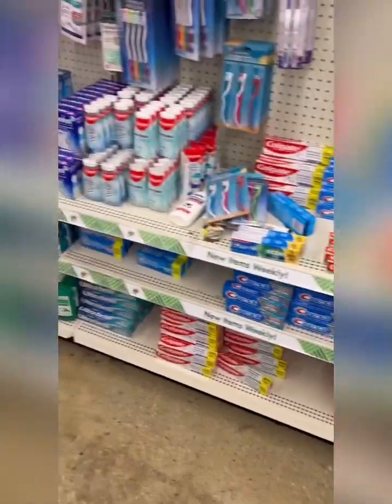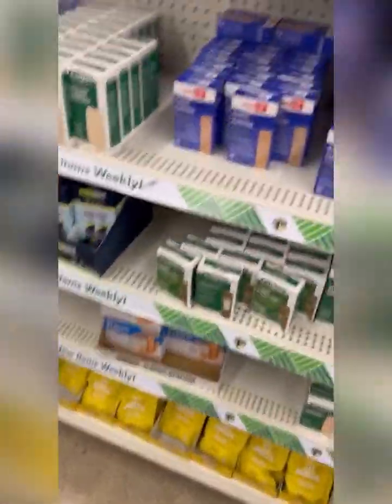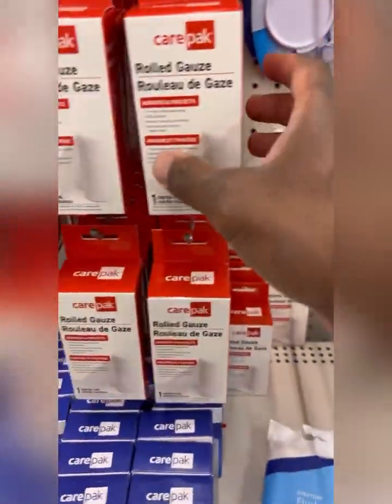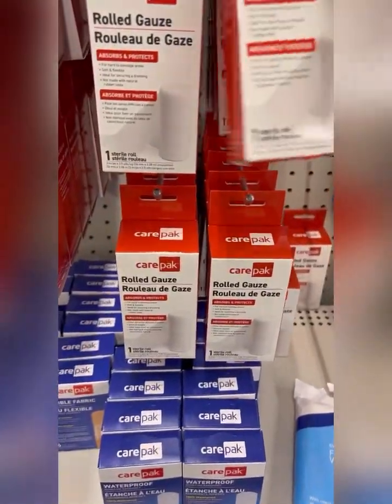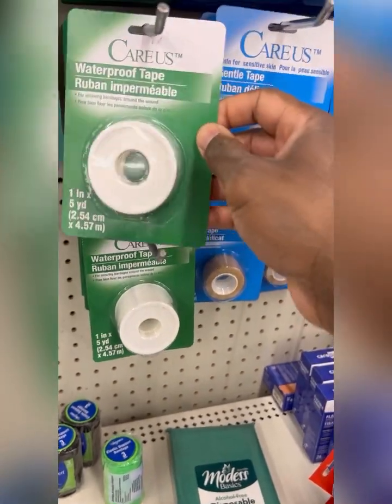Our first stop is Dollar Tree. Everybody knows about Dollar Tree. We're going to get some extra large plastic band-aids and some care pack roll gauze — we're going to grab two of these. We're also going to grab some waterproof tape.